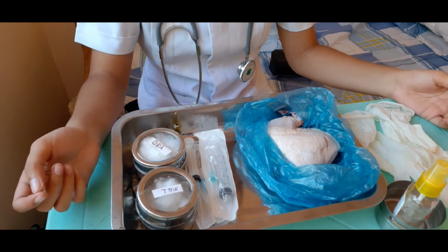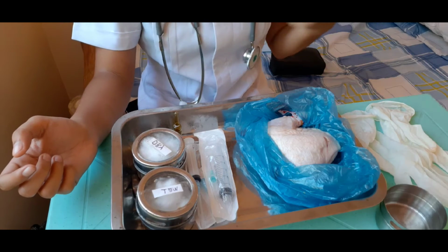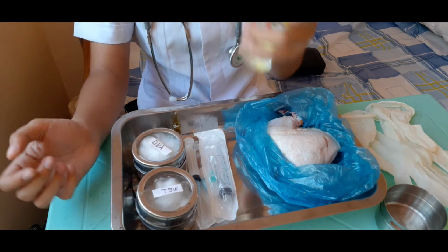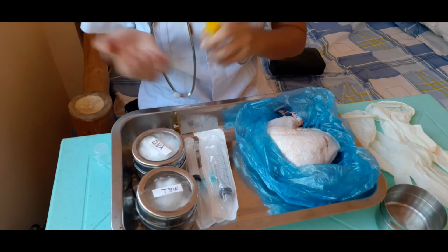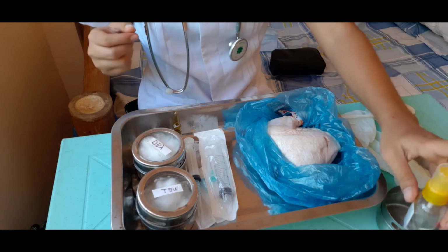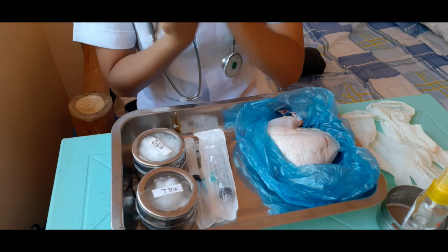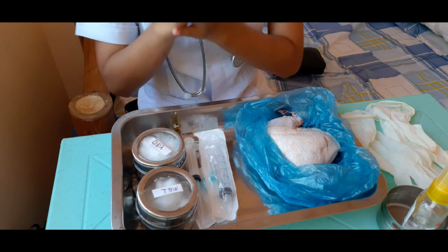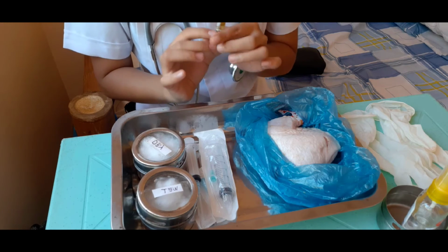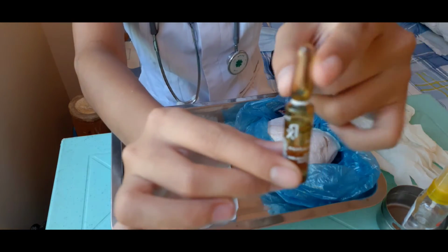First things first, we are going to perform hand hygiene and observe other appropriate infection prevention measures and procedures. So I have here the sanitizer and I'm going to put some on. The next is we are now going to prepare the medication ampule for the drug withdrawal, which is we are going to flick the upper stem of the ampule. So which is the upper stem? This is the upper stem of the ampule.